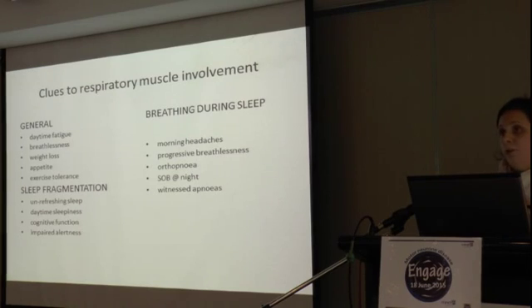We do know that the sooner you instigate non-invasive ventilation, the better quality of life it gives them. Obviously, they're having better sleep. And we all know, especially if you have little children, that you wake up frequently during the night because your sleep is fragmented, and then during the day you're just cranky. The same goes for our patients, plus it limits what they can do. We need to think of patients with motor neuron disease as though whatever they do during the day is like running a marathon, because their muscles are so weakened, and if you put respiratory failure on top of that, it makes it so much harder for them to manage.